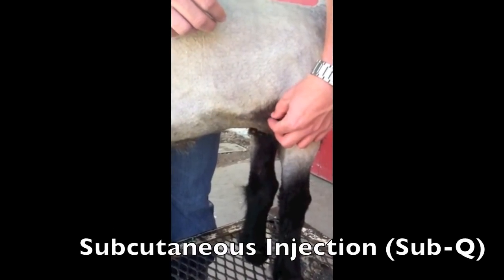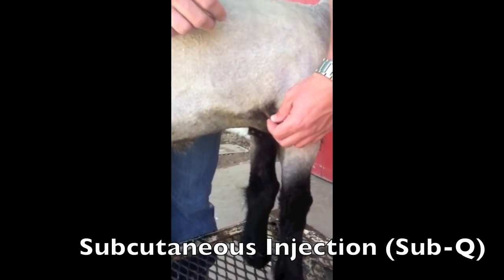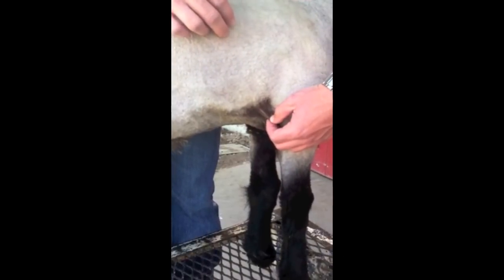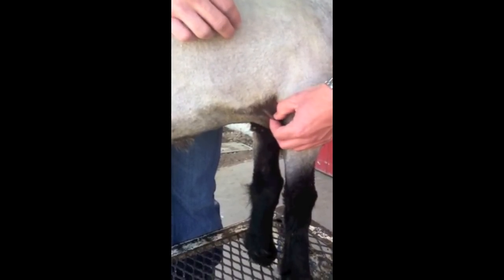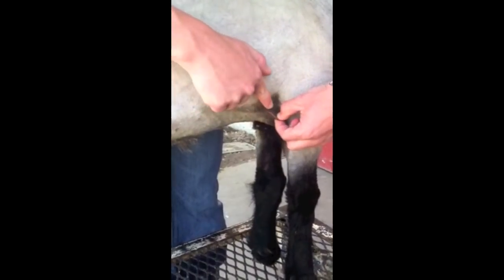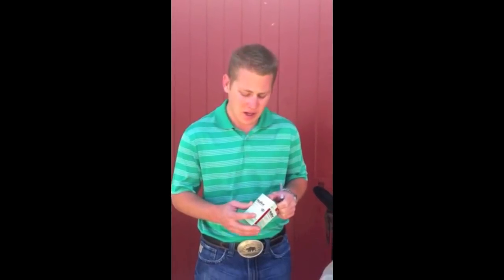The second injection site is what we call subcutaneously. Subcutaneous refers to being right under the skin. In this example, I'm pulling the skin here in the foreflank, and this would be an ideal location to give the medication, directly right here under the skin.